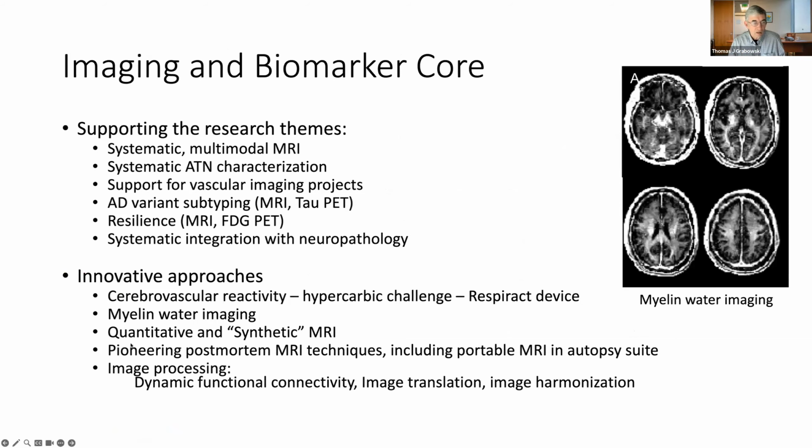There are a number of innovative approaches as well that we make available. Swati may talk about some of these. We can measure cerebrovascular reactivity, which is a way of looking at the integrity of the physiology of the small vessels. We can image myelin water by a couple of different approaches.